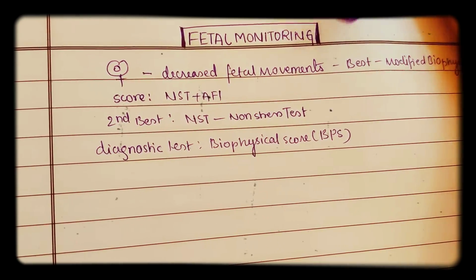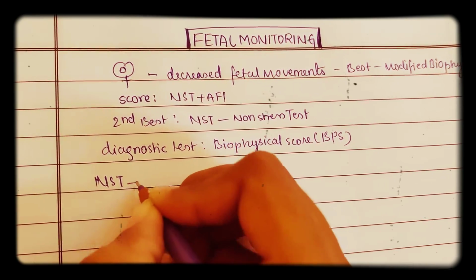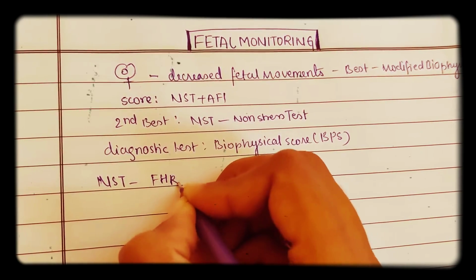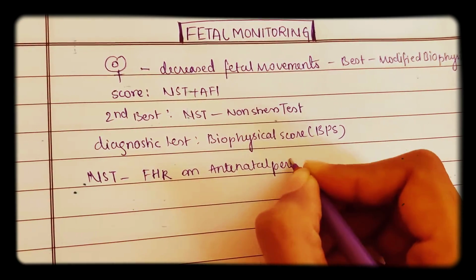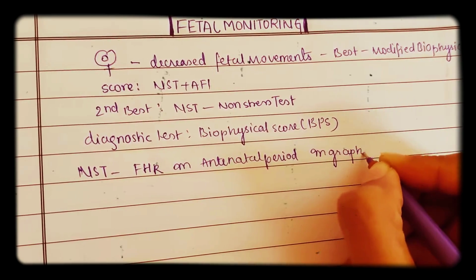Now let us see in detail what is non-stress test, that is NST in short. Okay, non-stress test is useful to evaluate the fetal heart rate especially in the antenatal period. So in the antenatal period, if you want to know the fetal heart rate, especially in a graphical manner, then you do this test.